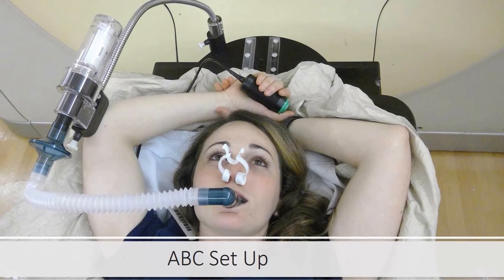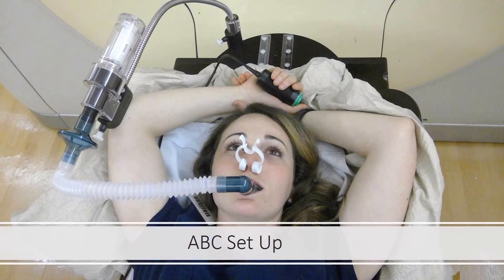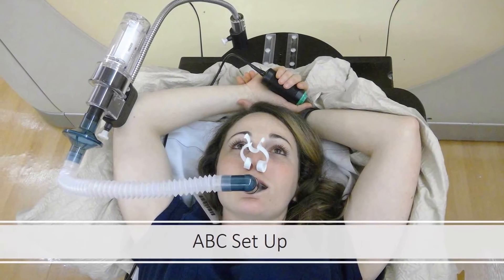This photo depicts what a general ABC setup looks like. You have the vac lock bag with the arms above the head holding the green enable button. The nose clip is properly placed on the nose and there is a tight seal around the mouthpiece that is hooked up to the transducer.